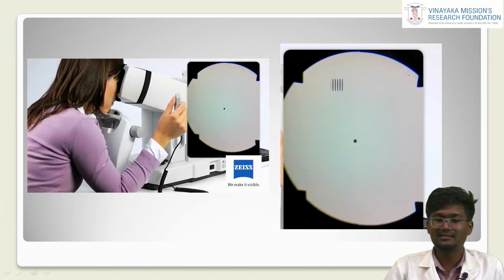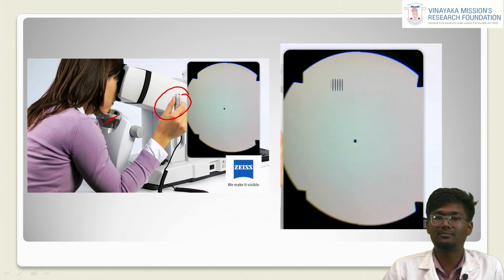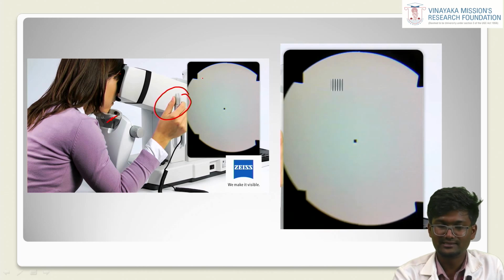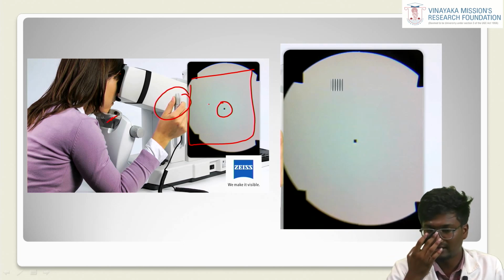This was the clinical setup of FDT, similar to white on white perimetry. We need to place our chin here, and give the patient a remote, and when the patient sees the target, they are asked to press the button. This is the opening of the screen. This is the patient view. We need to tell the patient to fixate at the center. Similarly for the right eye, afterwards the left eye.